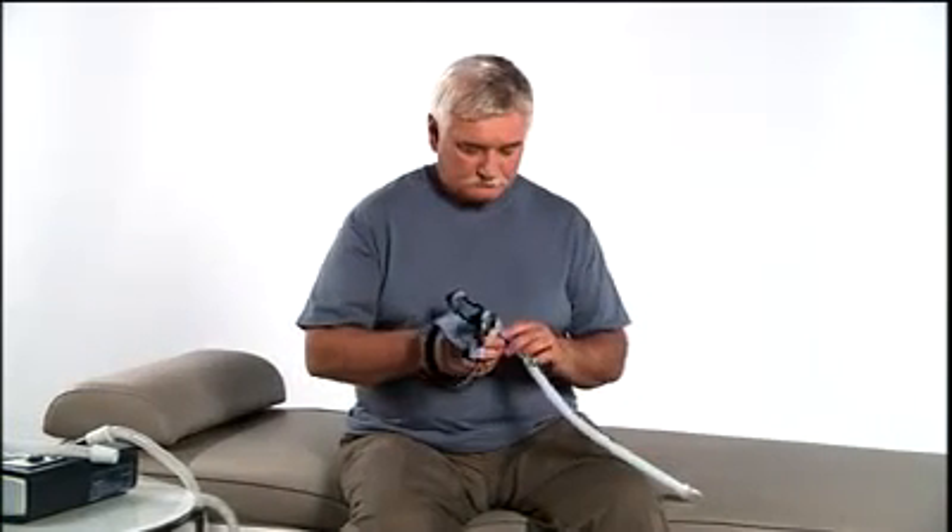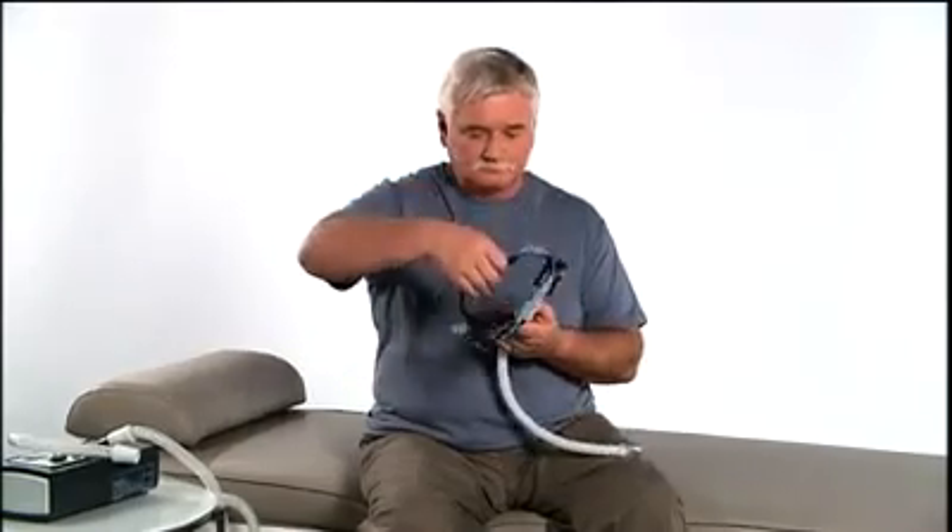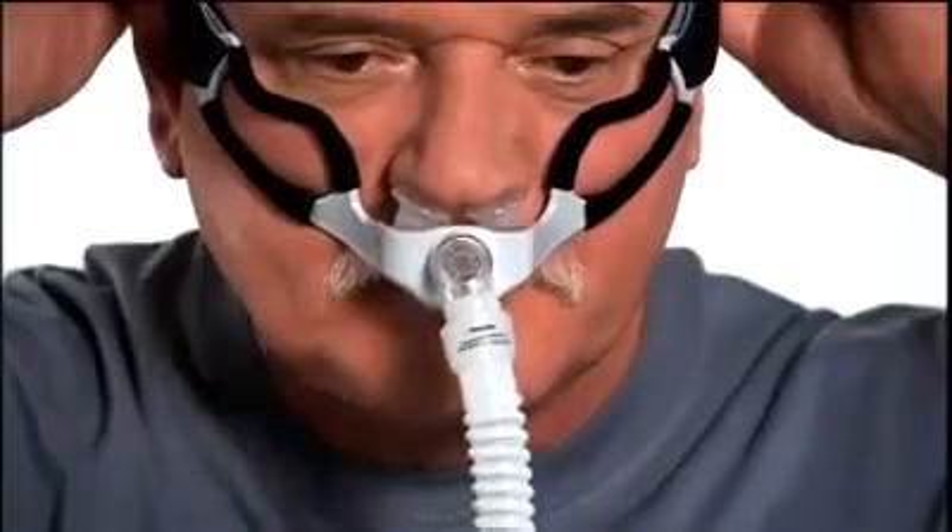Go Life is designed to go on quickly. To put the mask on for the first time, pull the headgear over your head. Place the cushion into your nostrils. Make initial adjustments while you are sitting up.